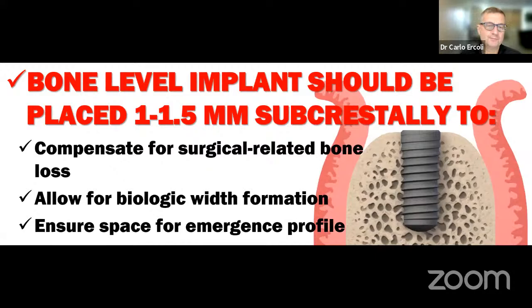You will allow for the biologic width formation. Remember, we said generally those tissues, more often than not, are only 2.5 millimeters thick. So if we need to anticipate the biologic width of about 4 millimeters, we perhaps need to place the implant a little deeper. And plus, you may have a little more space to design your emergence profile.